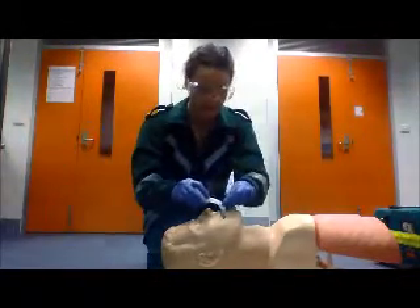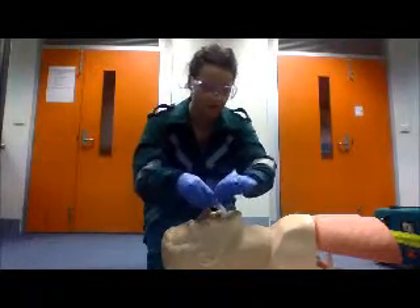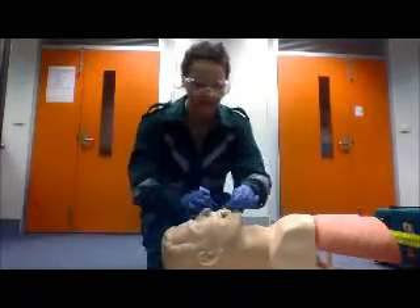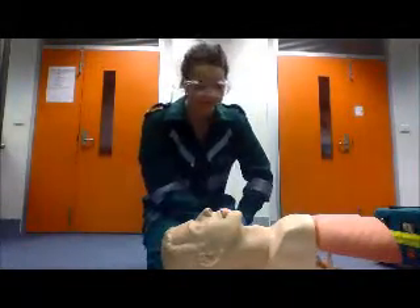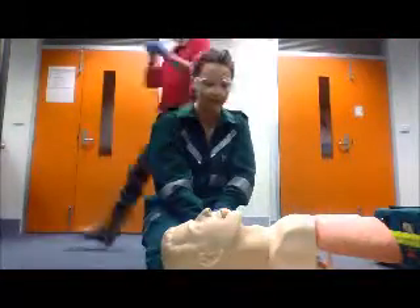First you need to insert the OPA upside down, rotate it around, and push it down. The flange should not be squeezing the patient's lips too tightly between the flange and the teeth. A contraindication for an OPA is if the patient has trismus or a working gag reflex.